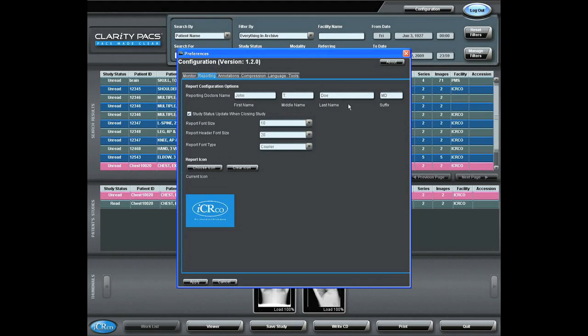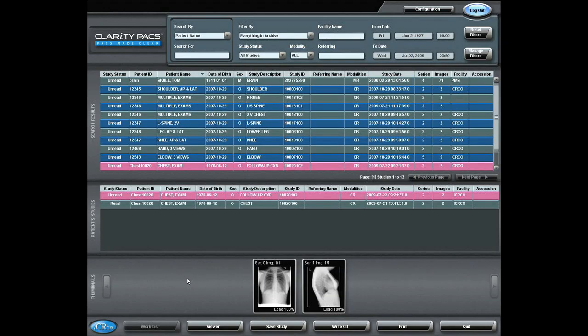Once that has been done, I will save that, and that is a one-time setup.